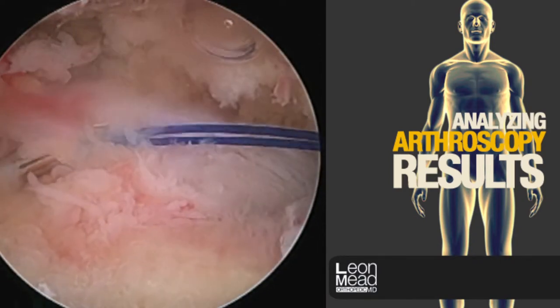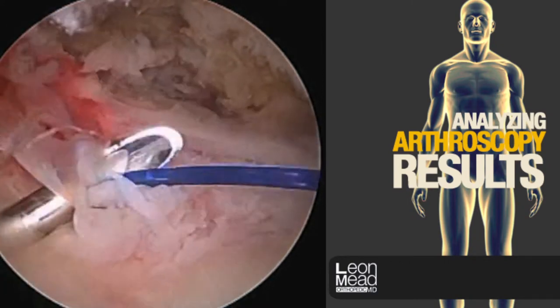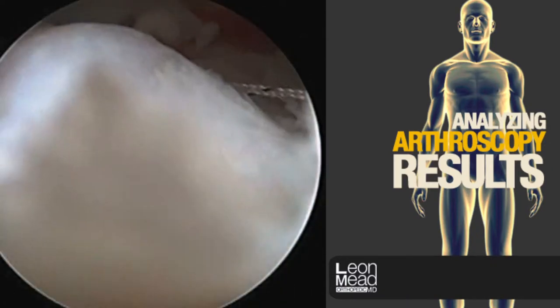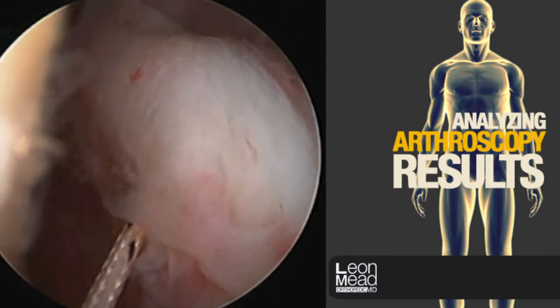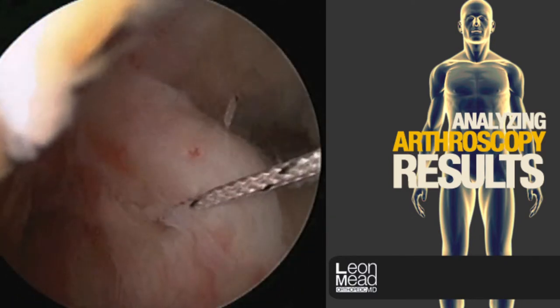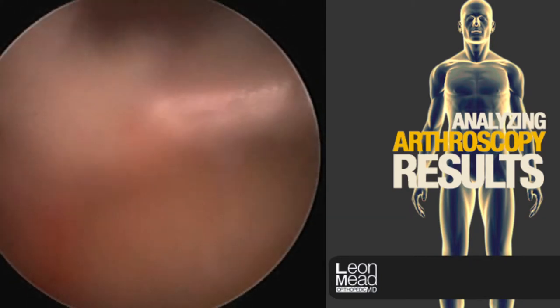Here we've used our suture passer to pass a side-to-side suture through the L-shaped portion of the cuff. We can see that it's going to secure the two segments of the cuff together, thereby converting this somewhat more complex tear into a more simple pattern.